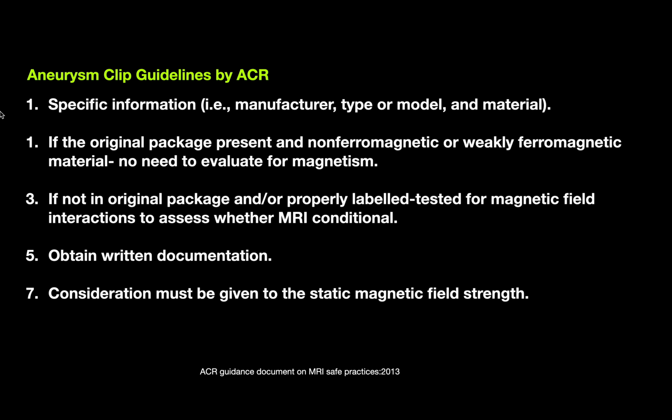So, aneurysmal clip guidelines by ACR. For aneurysmal clips, specific information should be available for the manufacturer, type and model, and material of the aneurysmal clip. If the original package is present and the material is non-ferromagnetic or weakly ferromagnetic, then there is no need to evaluate for magnetism.